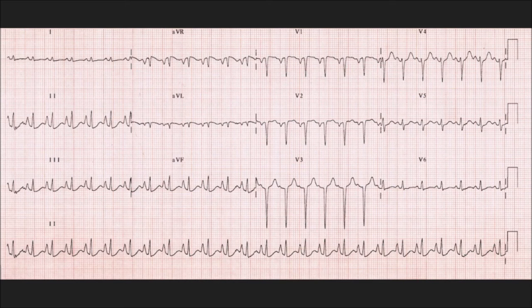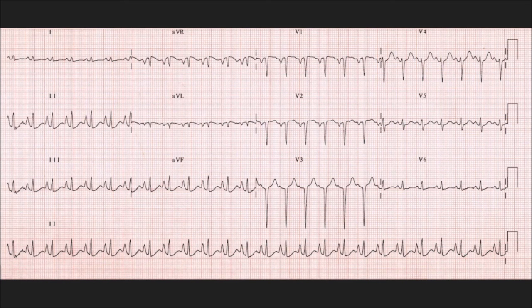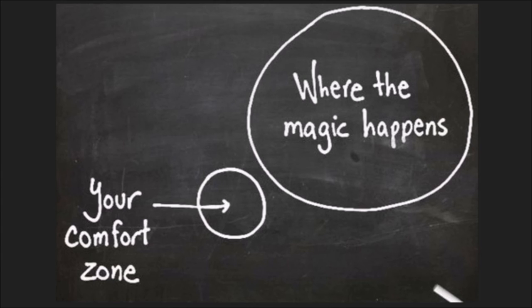You would see some right axis deviation if there were degree markers on this. You can calculate the axis of an ECG by looking at the most equiphasic lead — there are other videos online to show you how to calculate that. This is something you want to study on your COPD patients and use your online resources to familiarize yourself with this type of morphology, so you'll be prepared to recognize and treat something that maybe doesn't have an official diagnosis yet.